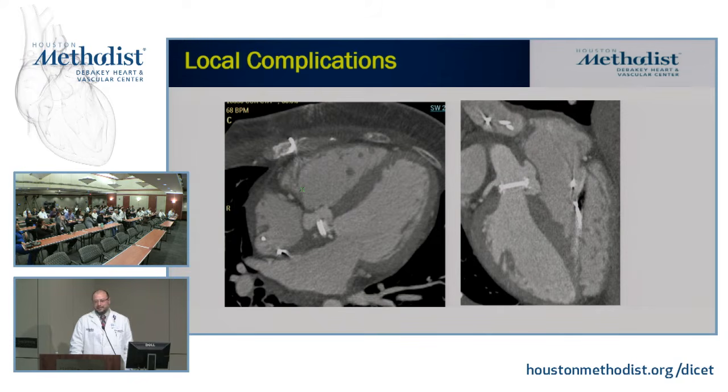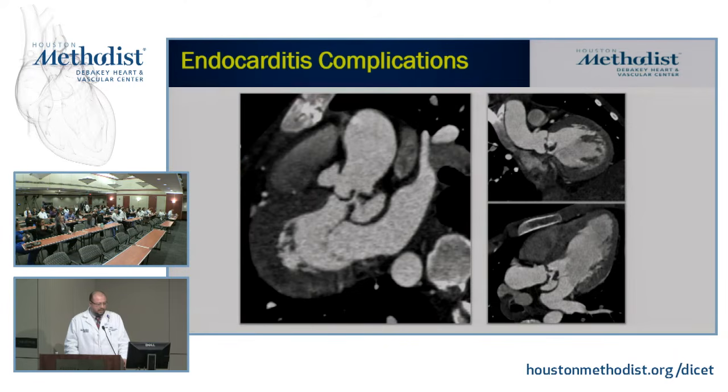So we are not seeing every endocarditis, and I don't think every endocarditis needs a CT for confirming the diagnosis. If we clarify that, this is more of a second-tier test that you need for patients with a complicated course, with unclear diagnosis, with potential complications, both local, like this patient who has an aneurysm, or those who have fistulas, or those who are not improving with therapy.